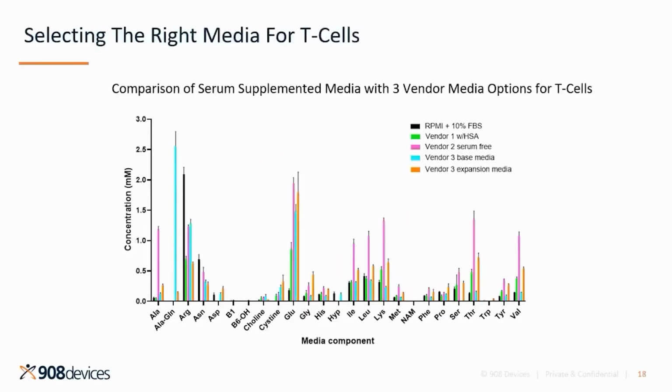When culturing advanced therapies derived from T cells, early experiments typically adopt the traditional media platform of RPMI media supplemented with 10% FBS. However, there is a growing desire to use chemically defined media that excludes serum and other animal-derived components. The adaptation of a cell line from serum-containing media to a fully chemically defined media is challenging though, especially when no insight into the media is known ahead of time.